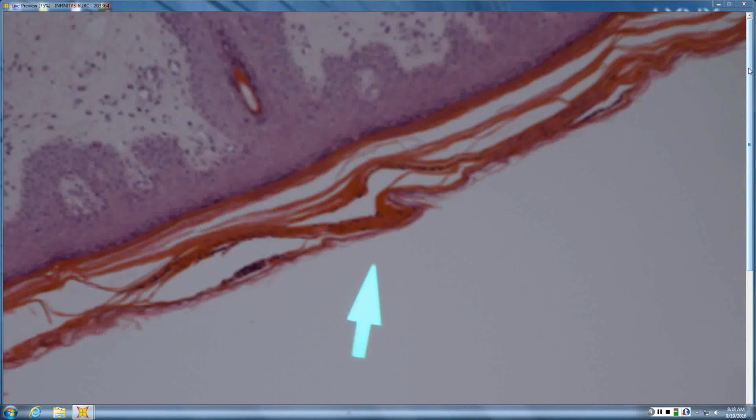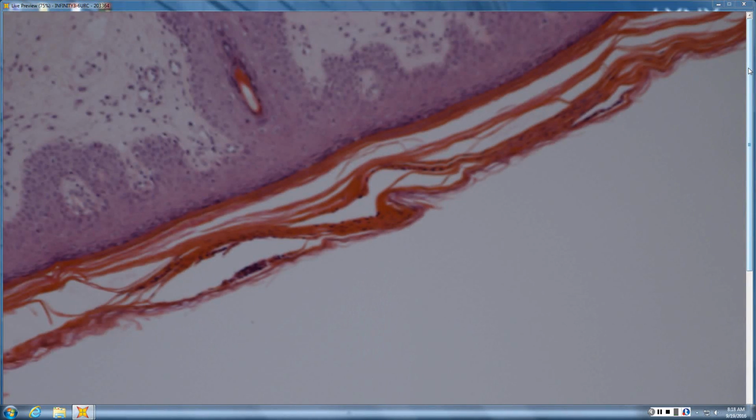Neutrophils, para, neutrophils, para. I was trying to think of what would be. So what gives you sandwiching? Neutrophils, para, neutrophils, para. Psoriasis. Yeah, very good. This is next week. Different chapter, okay. That's okay.